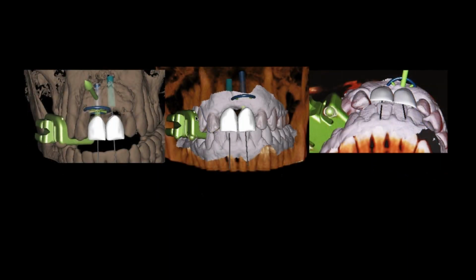So I scanned him intraorally and superimposed the scan and put teeth that were going to be proportional to what he needed. These are 11 millimeter tall teeth. And you can see obviously the lack of the papillae in between. And I told him, unless I do a bunch of surgery on you to bring that bone back down, you're going to be stuck with that. He says, I'm fine. And the dentist is going to put some pink material in it. But we knew that before the implants went in, which is what I wanted to show you.